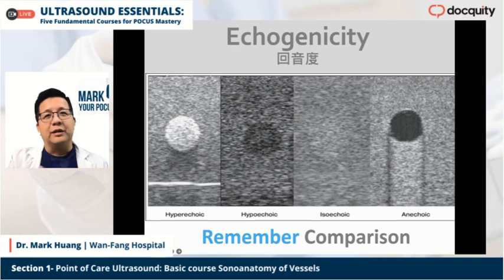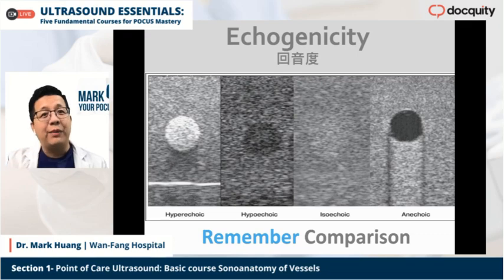It means the baseline is the liver parenchyma. This lesion is more hyperechoic than the liver parenchyma.